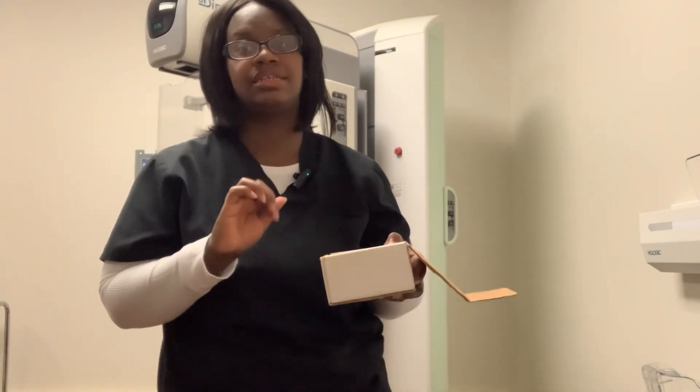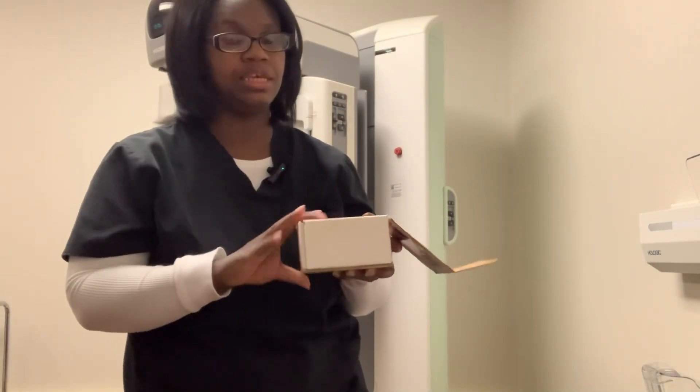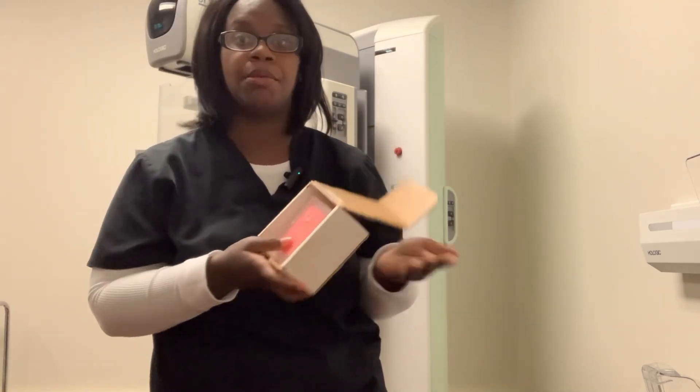Hello everyone, I'm Marian. In today's video, I'm going to do the compression thickness with the Phantom and Mammography.